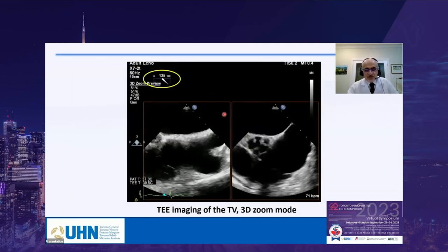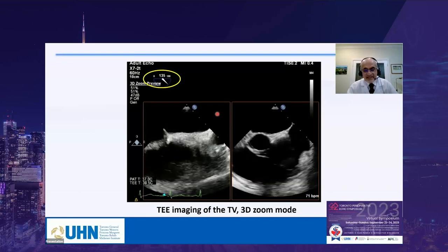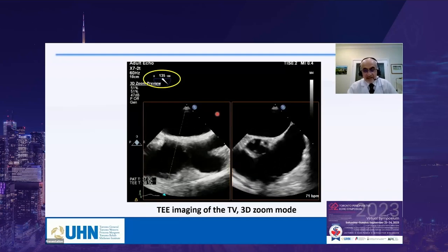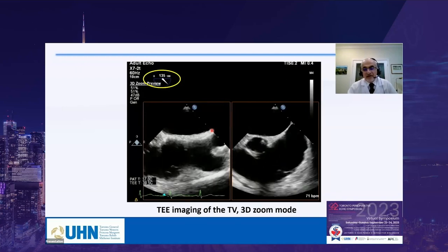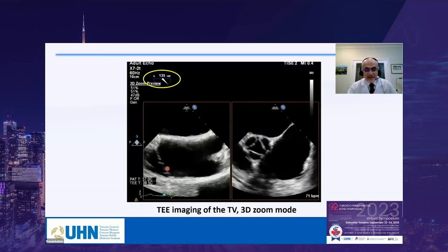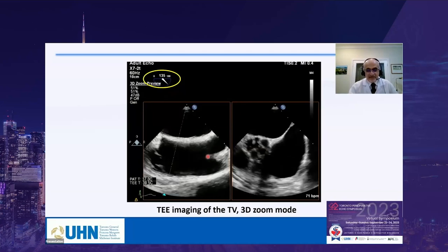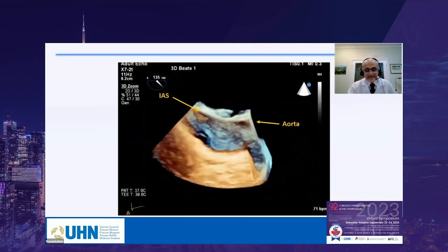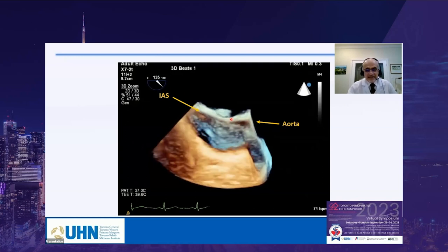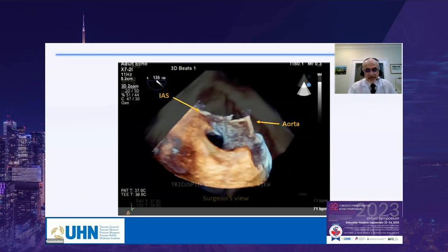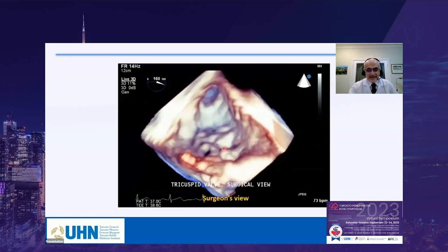How do I acquire the 3D TEE image of the tricuspid valve? The guideline suggests 0 to 30 degrees, but I believe each valve should be imaged in a plane perpendicular to it. The view that is perpendicular to the TV is approximately 120 to 130 degrees. I start with this view in 3D zoom mode, which yields an image with the IVC on one side and the aorta on the other. After rotating the image, we can identify the valve clearly — this is a secondary TR case, which is why leaflet definition is better.